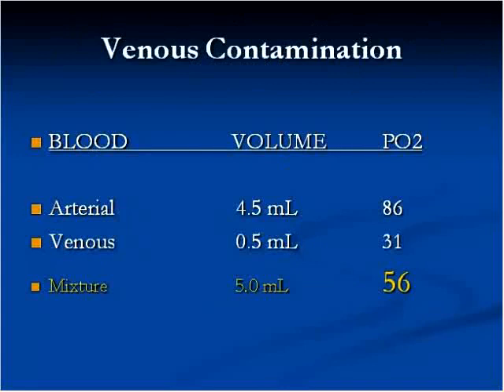And in addition to that, as the slide that I put up a minute ago, sometimes you will see an individual get a small amount of venous or capillary blood in it, and if you've drawn enough arterial blood gases, it's probably happened to you. It's just a little bit, and you mix it, then you get into the artery, and you get a somewhat contaminated sample.